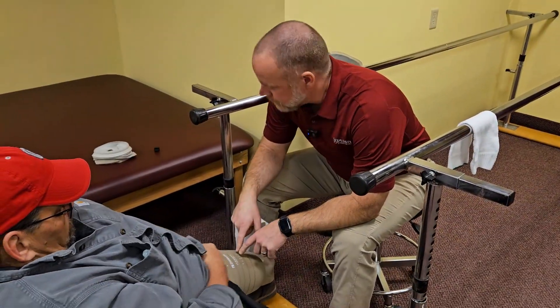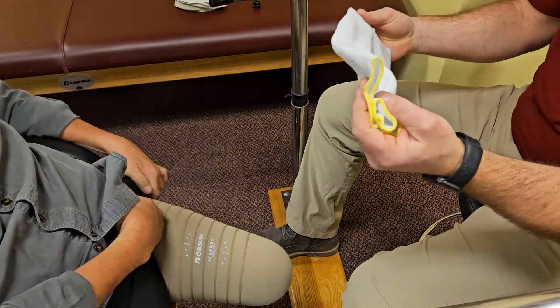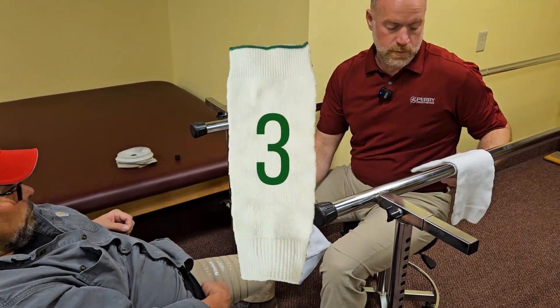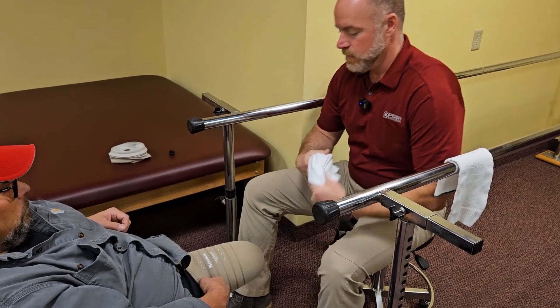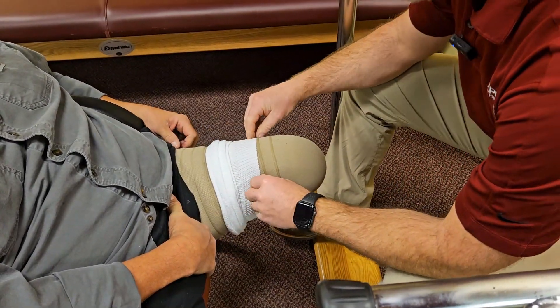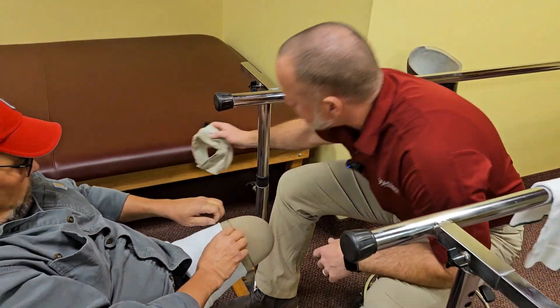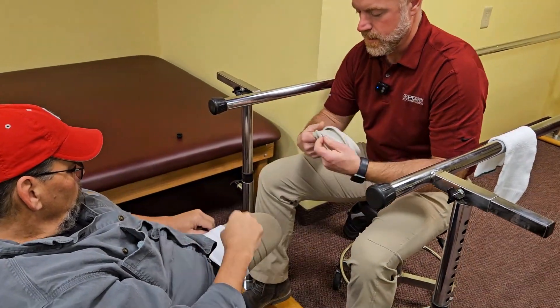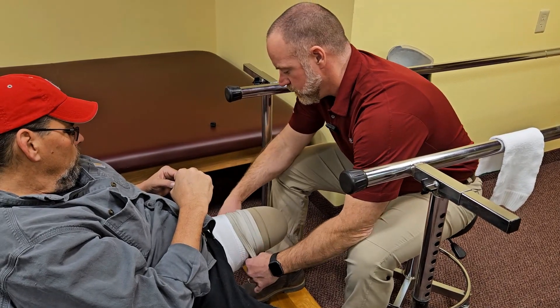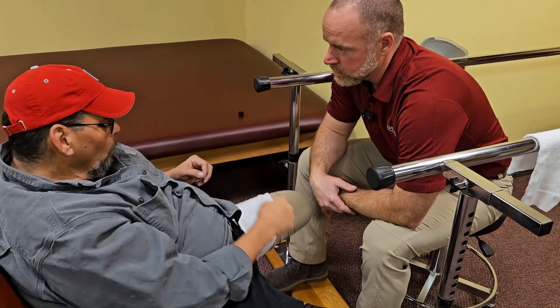Socks are essentially a uniform way to create increased contact and suspension within the prosthesis. This is a tube sock — both ends are open and they're color-coded: yellow is one-ply and green is three-ply. If either one isn't working well, give us a call and we can make adjustments. When you put this on, the color goes to the top. If you feel comfortable with your ring right at that second line, stop there, go a little bit higher, and fold it like that.